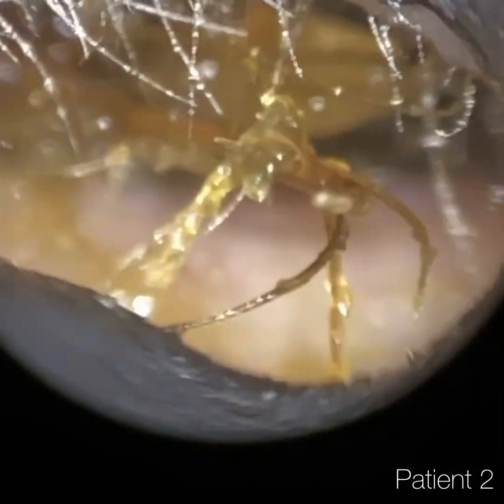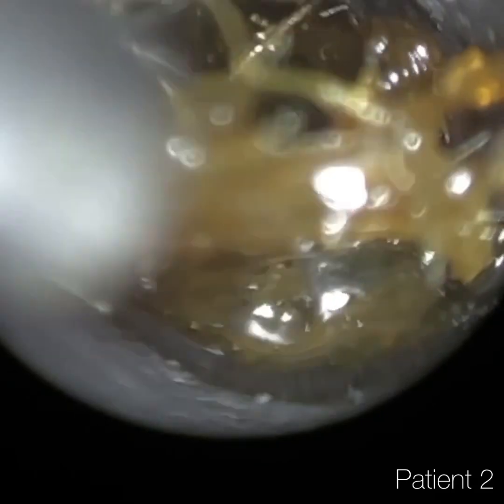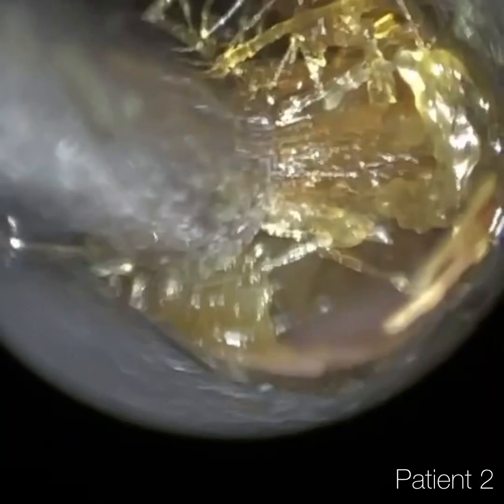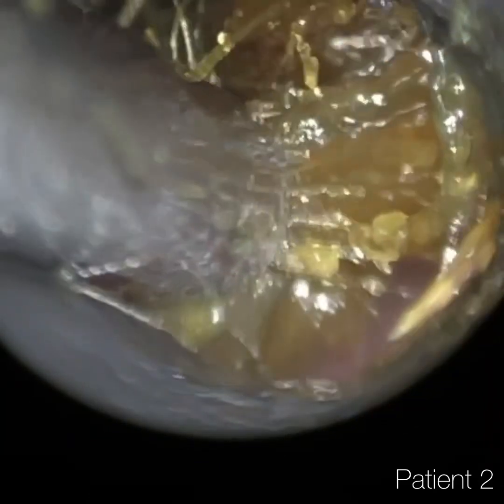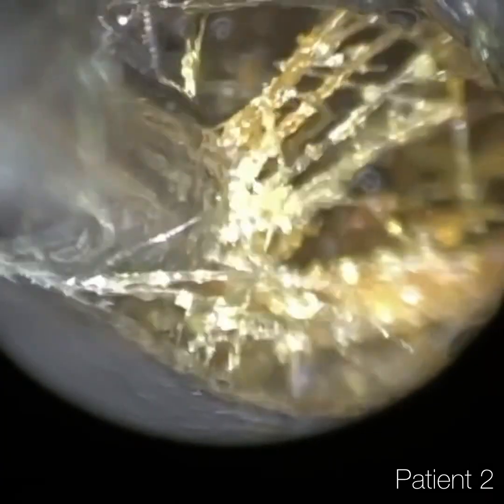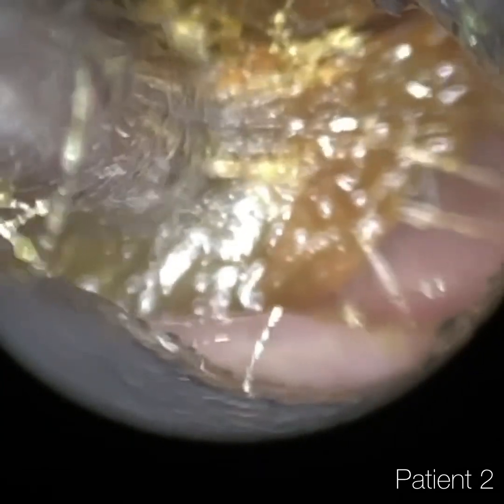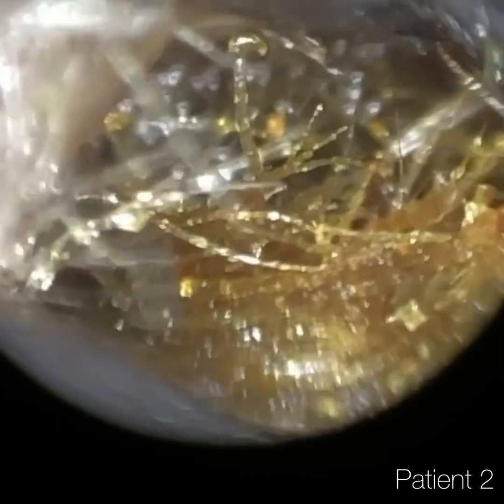So the more and more we're using the Waxscope, the more benefits I'm realising. Today I had a full clinic — all wax removals — and I managed to use the Waxscope with all the patients. It can be easy for me to revert to the ENT microscope because I'm so used to it, but I'm starting to really enjoy using the Waxscope now, as it has different benefits in terms of magnification. And of course, with the speculum, it does make it a bit easier to stretch the ear canal open.